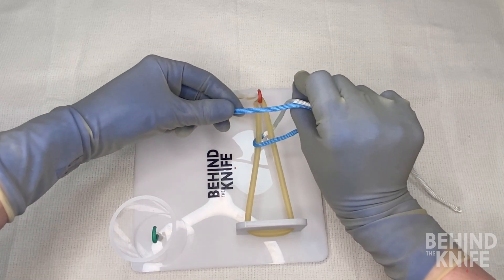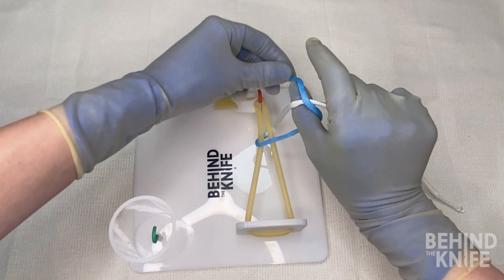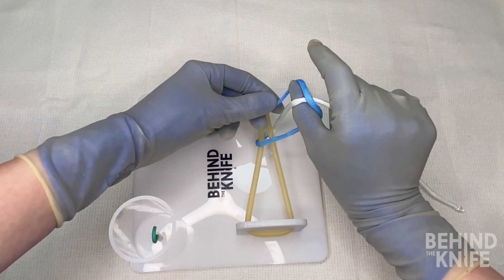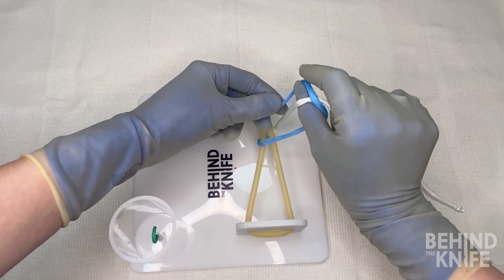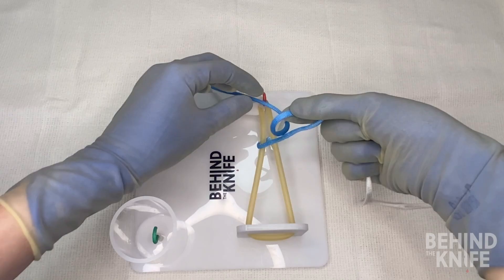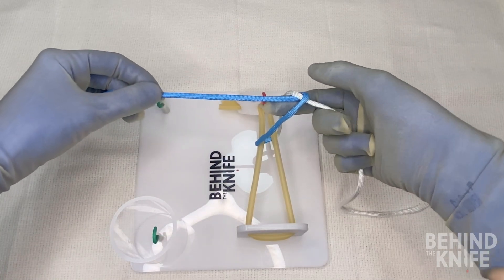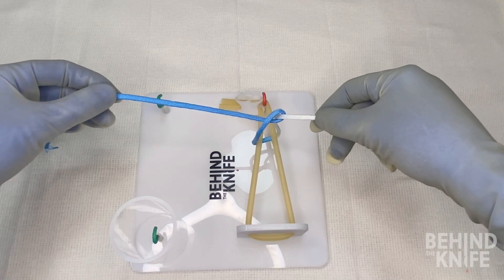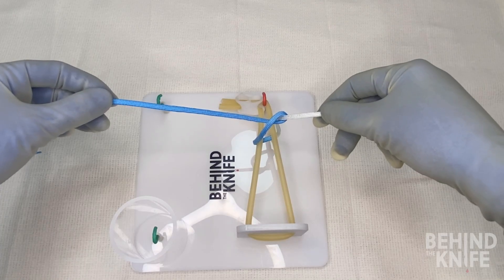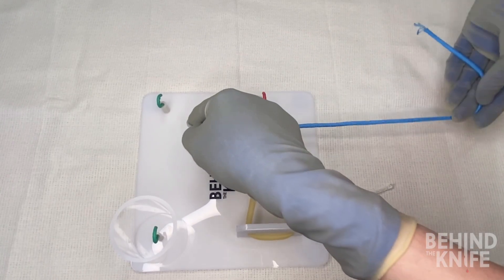From here we can unpinch our thumb and index finger, and we can use our left hand to drape the blue end of our string, laying it over top our thumb. We'll once again pinch our thumb and index finger together and rotate our fingers back to where they started, this time bringing the blue side of the string with us. Now, if this isn't exactly a square knot and we didn't cross our strings in the beginning, we'll need to cross our hands here to lay down a nice square knot.